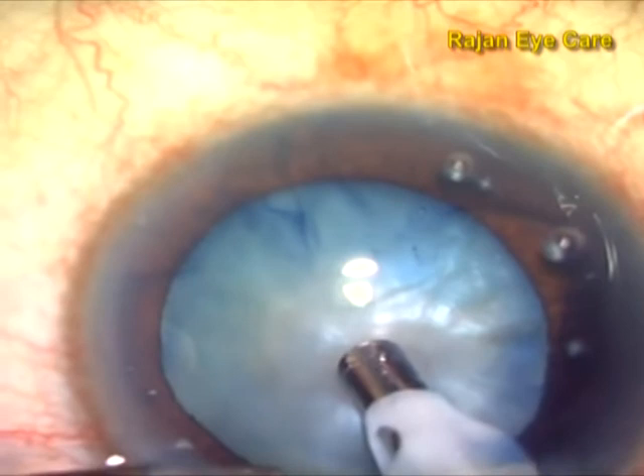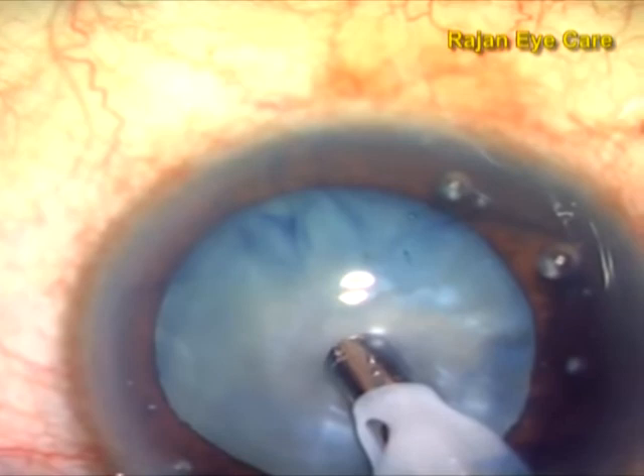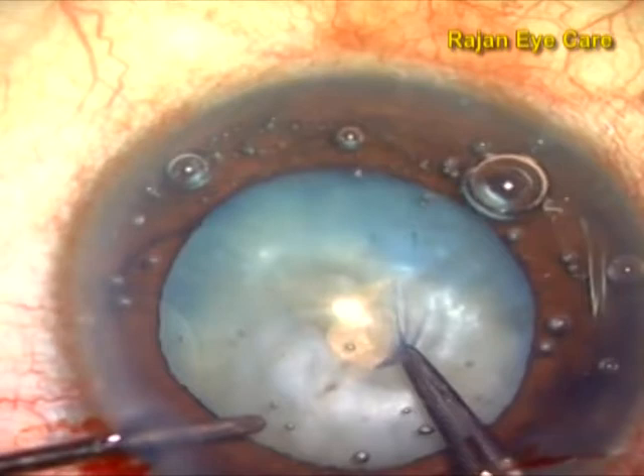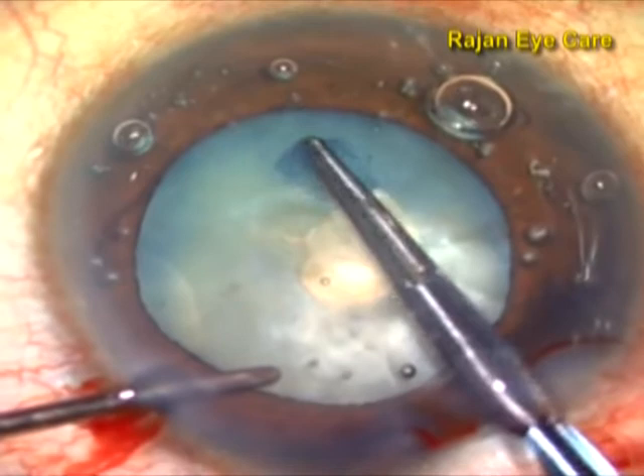When making the punch, the surgeon should go down full throttle on the foot pedal. This technique is called panchorexis. Once a punch is made in the anterior capsule, there is a sudden decompression of the capsular bag, and therefore no tendency for the anterior capsule to extend to the periphery, preventing the Argentina flag sign.